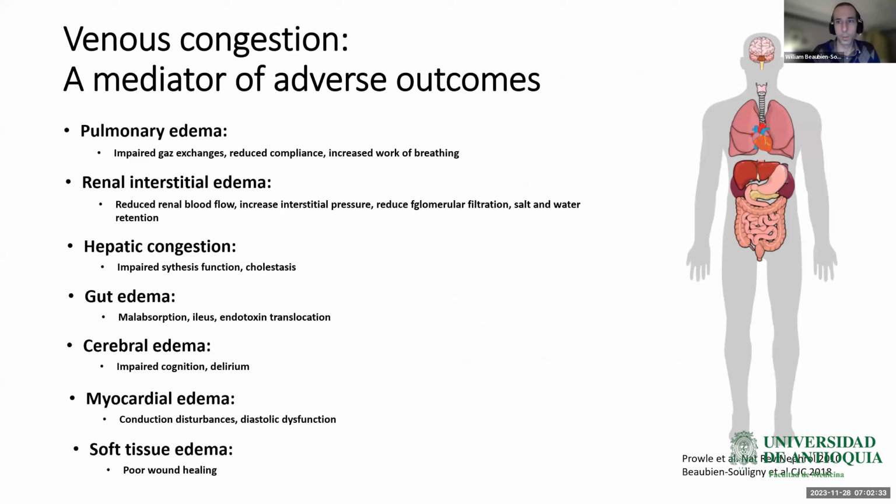So as you can see, this is a normal pattern of venous return. First there is the atrial contraction, which we can see on hepatic vein Doppler as a short period of flow toward the liver during the cardiac cycle. But then the dominant phase is usually the systolic phase, and there's the diastolic phase after that, which is usually of equal or lesser velocity.